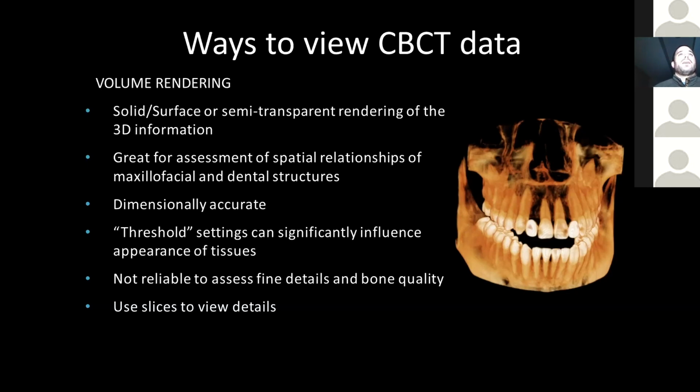So let me back up and say what we're trying to figure out is, do we have a patient who is at risk for sleep apnea and sleep breathing disorders? And can you see that on a cone beam CT? Well, the soft tissues in an apneic patient may look very different whether they're standing up or sitting up and awake versus lying down. They may look different if they're lying down and awake versus asleep, and they may look different if they are asleep and non-apneic or asleep and apneic. So there's a lot of variability, and even going back to the awake patient, just the position of their tongue, more anterior or posterior in the scan, can really throw off your volume and airway measurement.